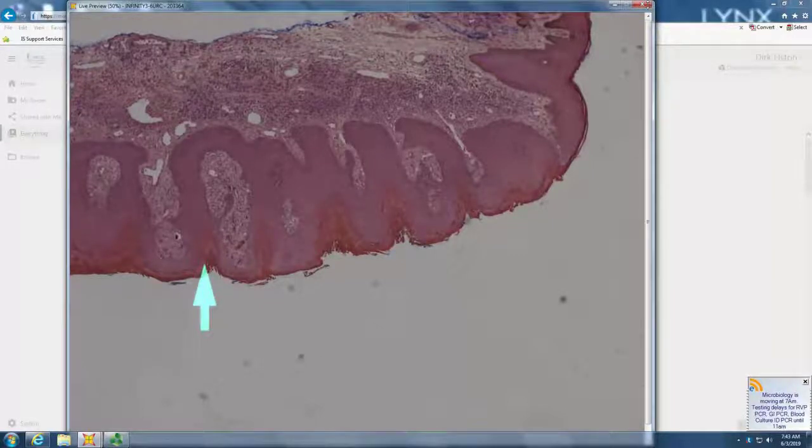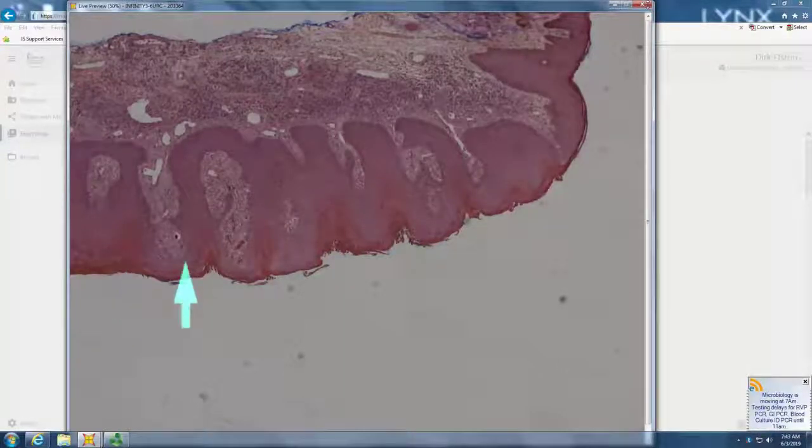What is it? All those red V's filled with neutrophils. Anyone? Verruciform xanthoma. So verruciform xanthoma, sometimes referred to as wart on fire, right? Because it's a little papillomatous and has all those red V's. It shouts its name at you with all these red V's on the surface.